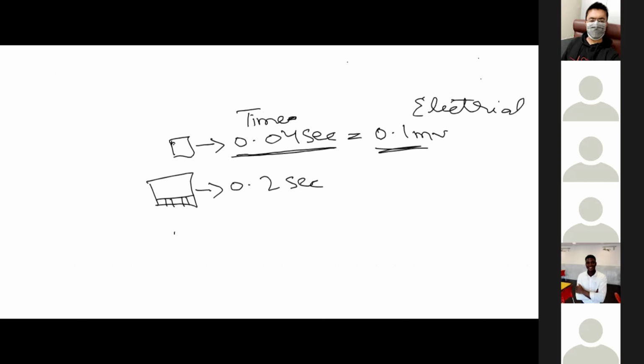Whenever you see an ECG, the first and foremost thing is to start with the name of the patient, sex of the patient, and the reason why we did that ECG. Fine.